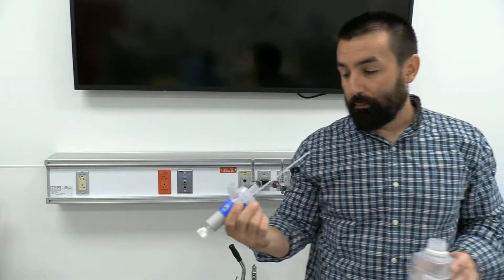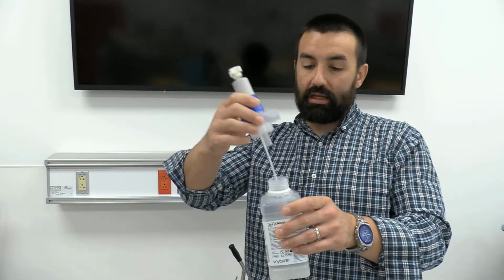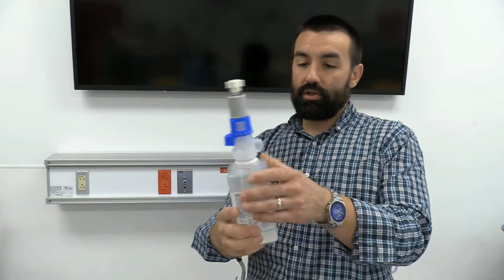It also has what's called a baffle if you look through there, and it ultimately just slows down the big particles that have no chance of actually making it to the patient and drops them back into the water chamber. You'll be able to see that when this thing's running. So this just drops down and in here. We're going to thread it on, making sure that you haven't cross-threaded anything.